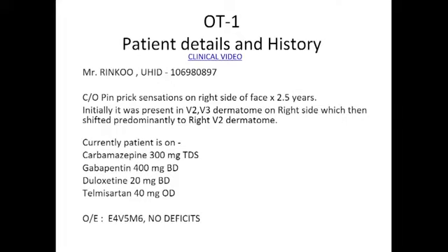Now, the position of the patient is very important. There is mild extension, but the important thing here is, when you are doing a lateral X-ray, you have to see that it's all parallel. So first, what I do is I break the parallel nature.